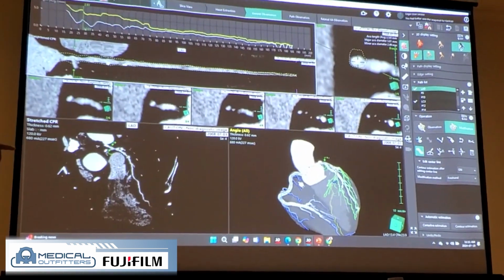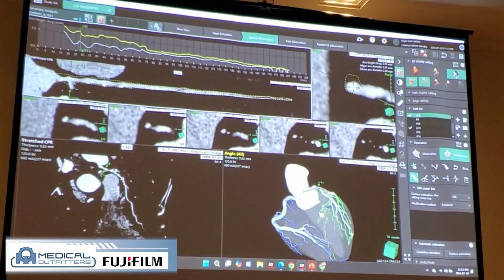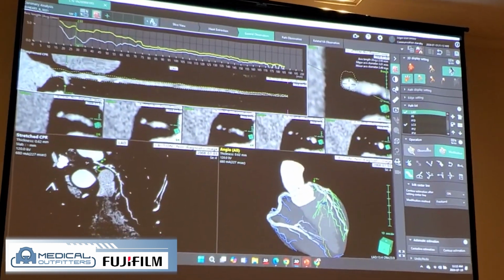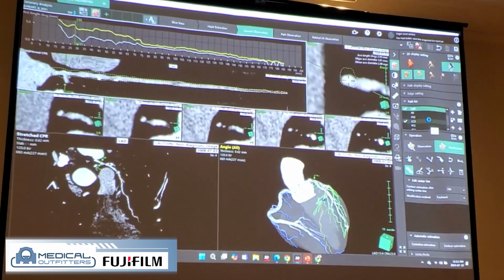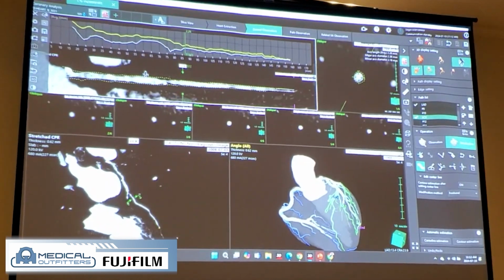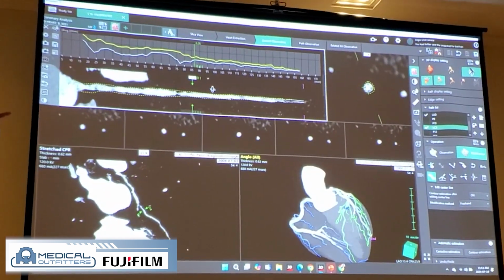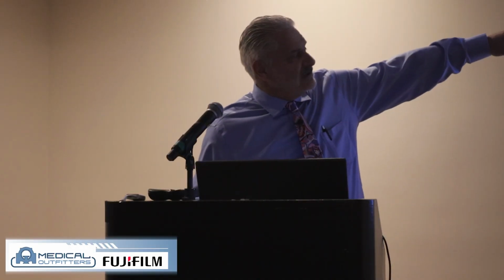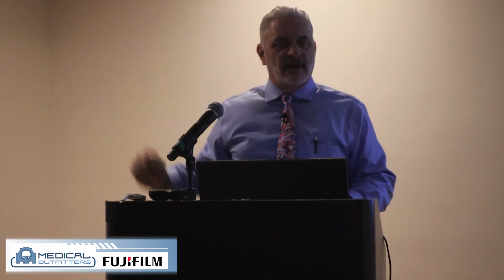And then we would come to the next one, and you can see all of the vessels here are highlighted. So if there was a specific vessel that you wanted to look at, you could open it from there. And the last vessel we would look at there is we would go over to the circumflex. And here's the circumflex, where there seems to be, even when we rotate here, a bifurcation, but there seems to be maybe a little bit of disease in there as well. So you could print these images out on any workstation. You could create a little DICOM simple report, which you could send over to PACS.